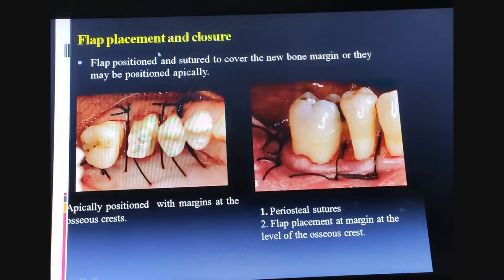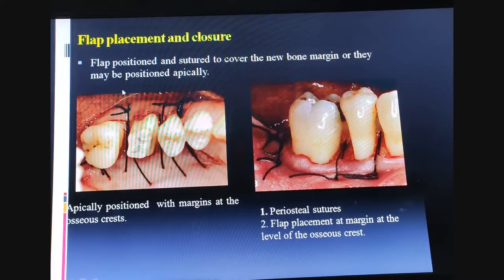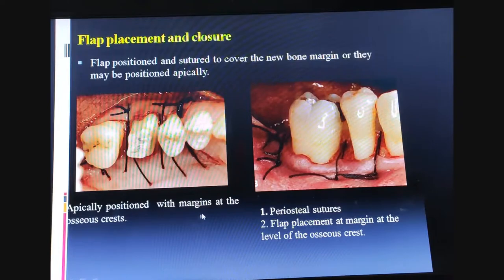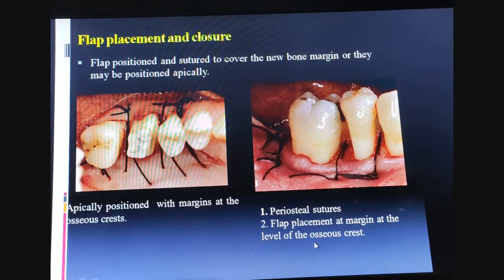Flap placement and closure: the flap is sutured to cover the new bony margin, or may be positioned apically with the margins at the osseous crest. This is achieved with periosteal sutures, with flap placement at the level of the osseous crest.